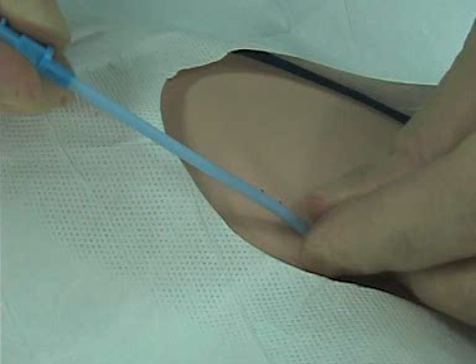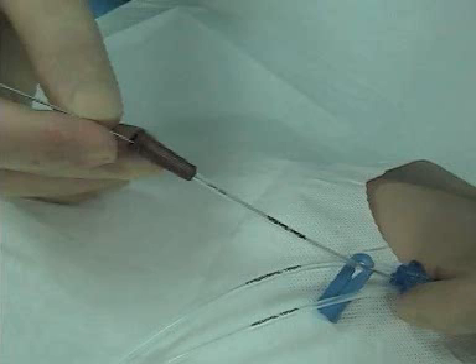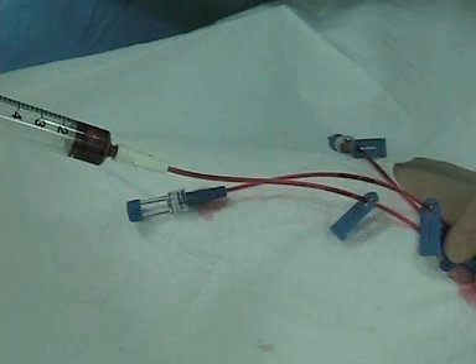After that, slide your catheter in. You can see the wire is coming out through the brown hub — that is the most distal hub, just the same as when you put a line in the neck. Slide it in, and once it's all the way in, pull the wire out. At this point, make sure you aspirate all the air out and flush all three of your lines so you don't get any clots in there.